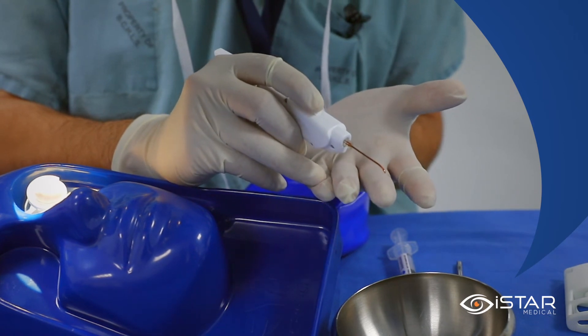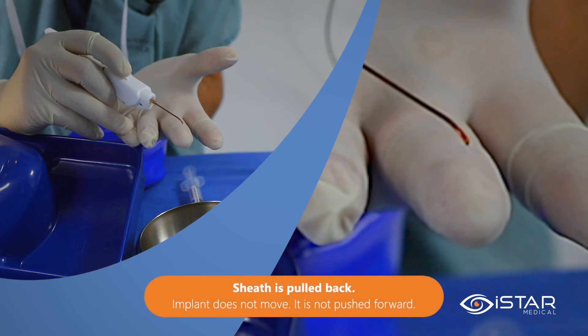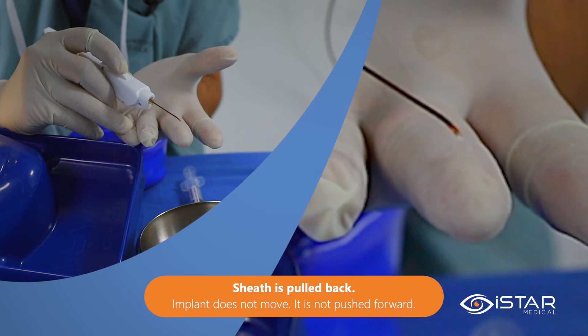To show this, I will deploy the implant onto my finger. You can see that by rolling the wheel backwards toward myself, the delivery sheath is retracted and the implant is released.